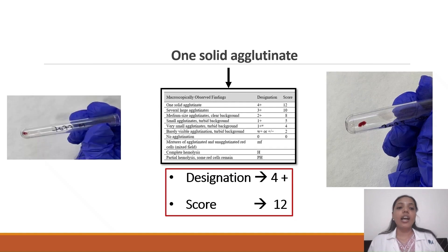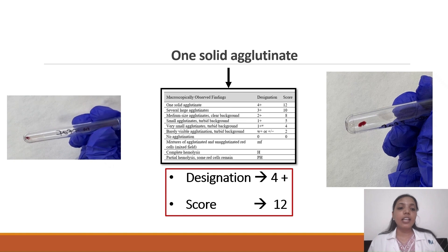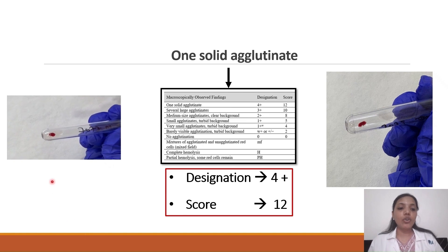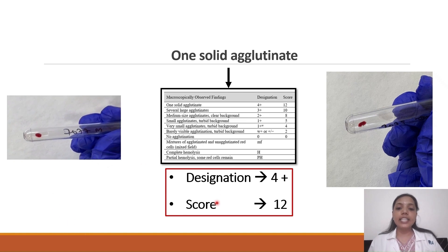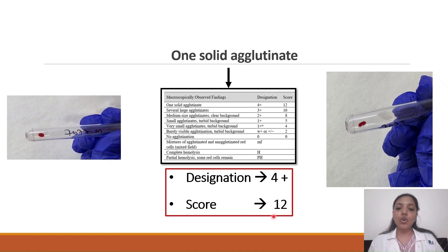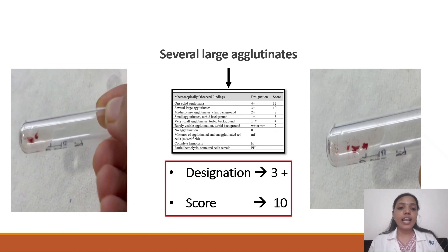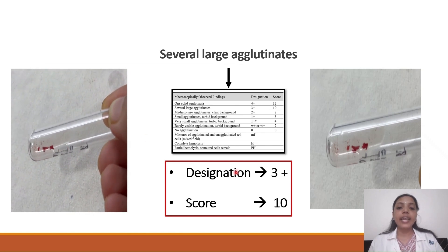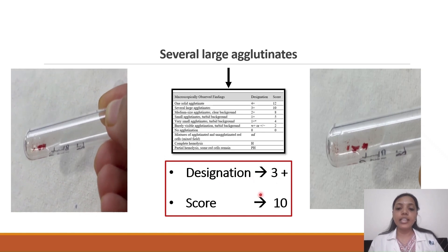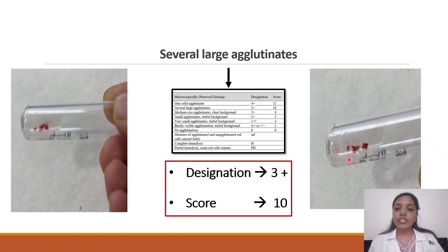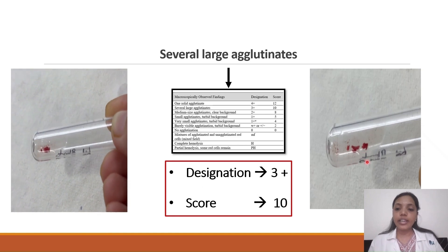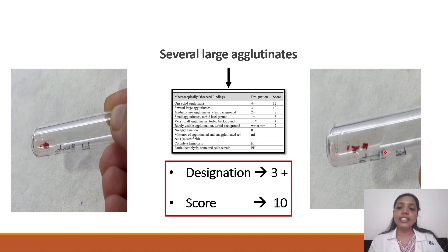In this image there is only one solid agglutinate present, hence the designation given is 4+ and the score is 12. Moving on, when there are several large agglutinates present, it is designated as 3+ and the score is 10.